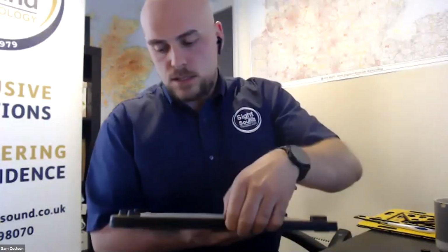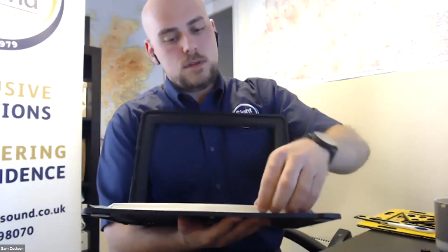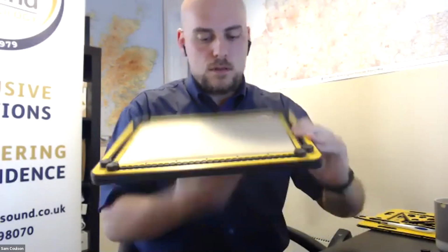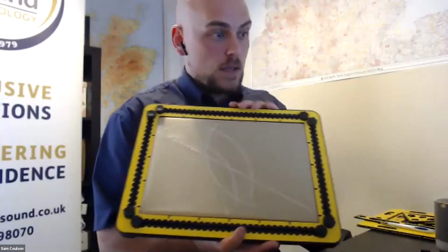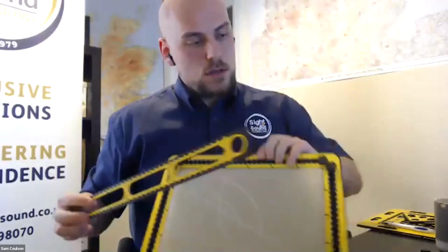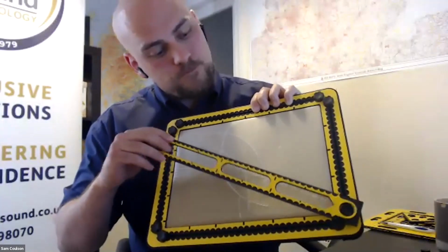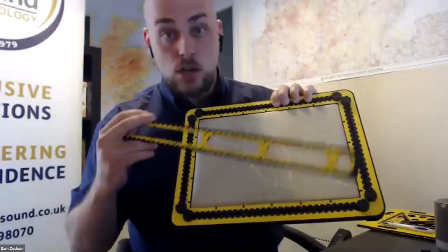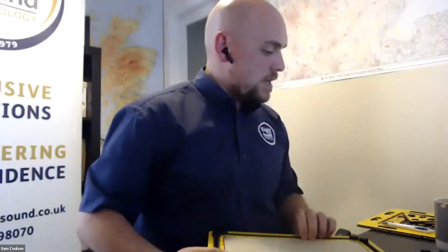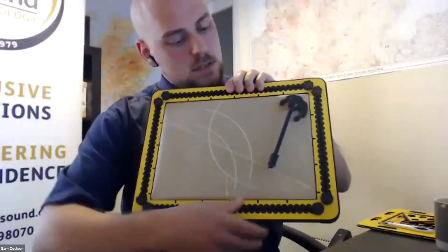How it works is the TactiPad opens just like this, and you can see here there's a piece of German film, which is what is embossed. That fits underneath this frame. You slot that down, and then we're ready to go. And it comes with a series of tools. You're given a ruler, which you can attach to the screws, or these little tactile buttons on the side. They actually unscrew, so you can attach tools such as the ruler. It comes with a compass as well, for instance. This is a magnetic compass, and it sits on the TactiPad just like this.